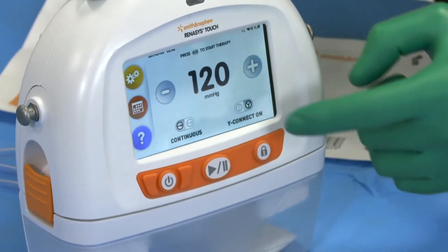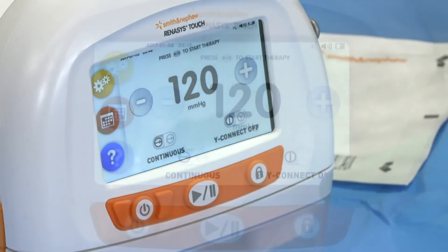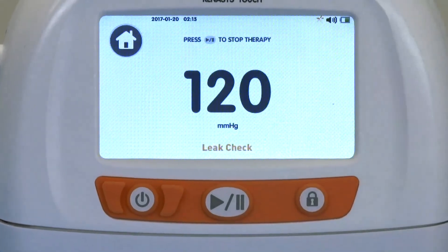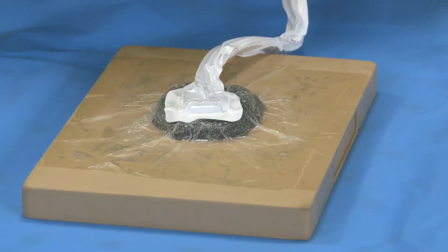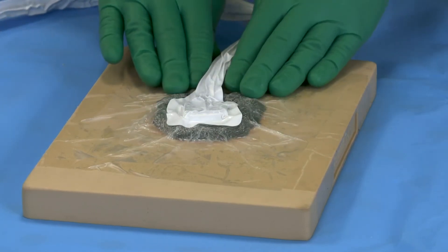If using a single soft port connector, ensure the Y connector mode is in the off position on the pump. To begin delivering therapy, set the pump to the desired pressure and press the Start Therapy button. Finished foam dressings should be leak-free and firm to the touch. Routine inspection of the negative pressure wound therapy device and dressing should include visual inspection and palpation of the dressing.